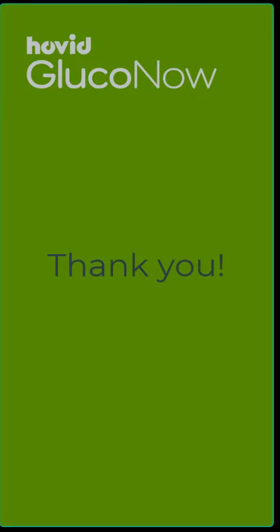This completes our overview of how to sign up and create a user profile to start using the GlucoNow app. Thank you.